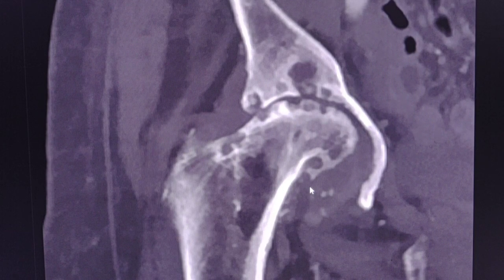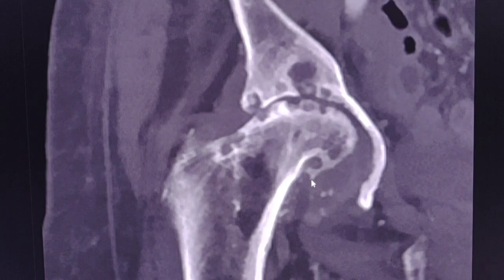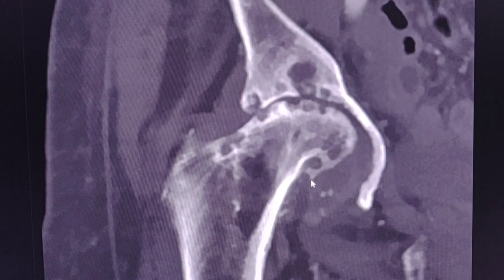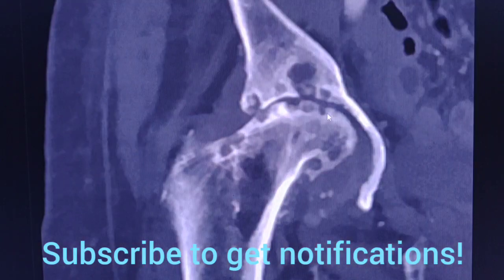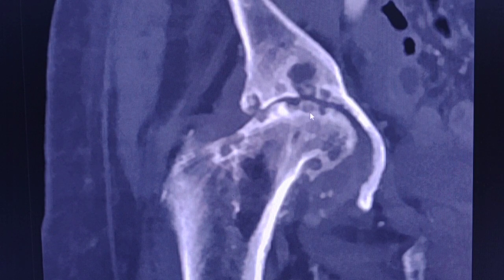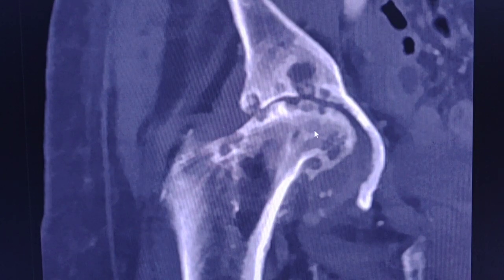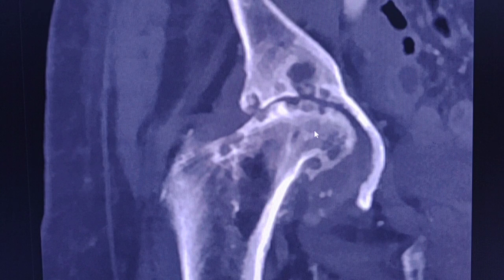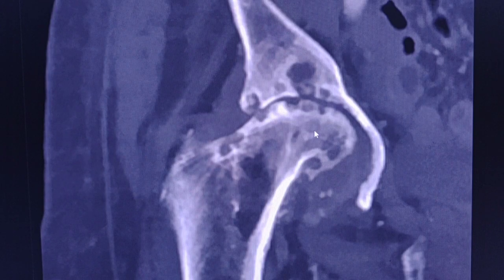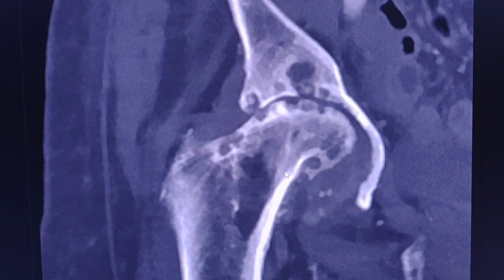Another point I would like to mention is that we must never confuse these lesions with geodes, like in this case. Geodes are subchondral cysts or pseudocysts and they are also well-defined lytic lesions in the periarticular surfaces. They are usually symptomatic and always associated with some other pathology — most commonly osteoarthritis, rheumatoid arthritis, osteonecrosis, or amyloid arthropathy — and the clinical presentation and history are different.